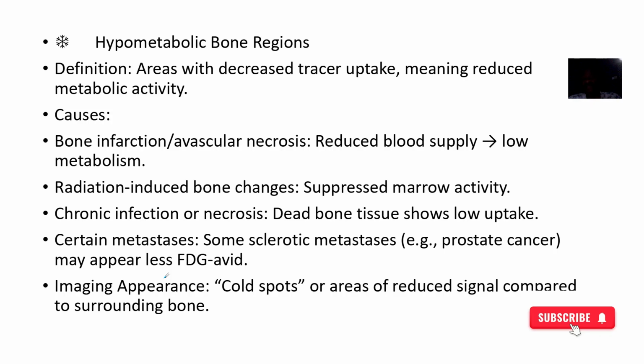So hypometabolic is just the direct opposite of the other one. So they're just areas with what? Decreased tracer uptake, meaning there's reduced metabolic activity. Maybe bone infarction, avascular necrosis, reduced blood supply, radiation-induced bone changes, chronic infection or necrosis, some certain cancers.